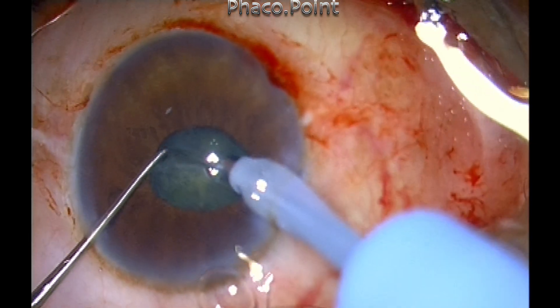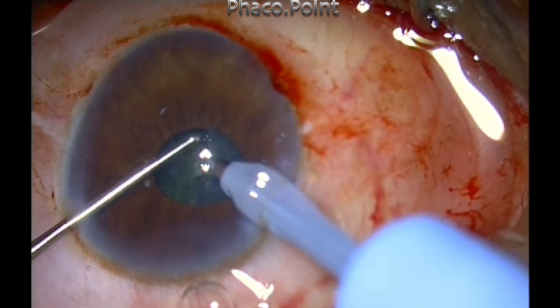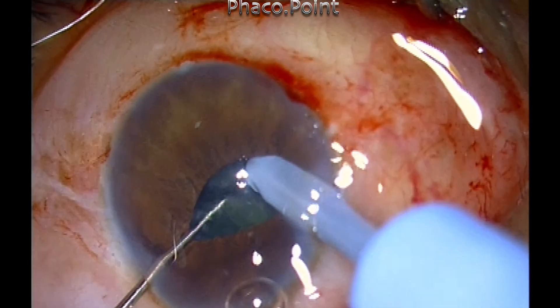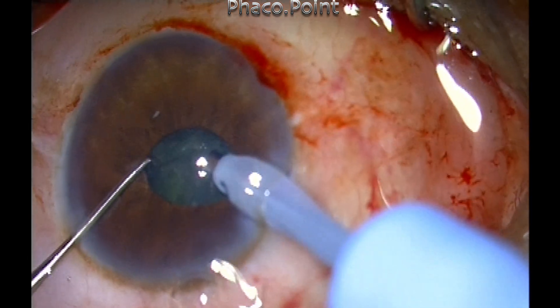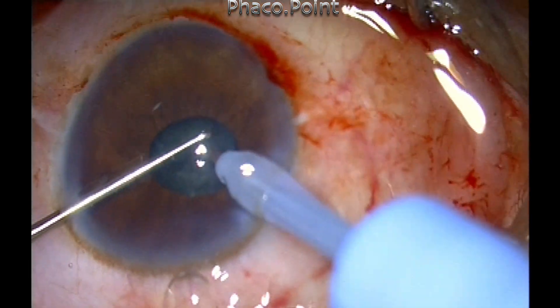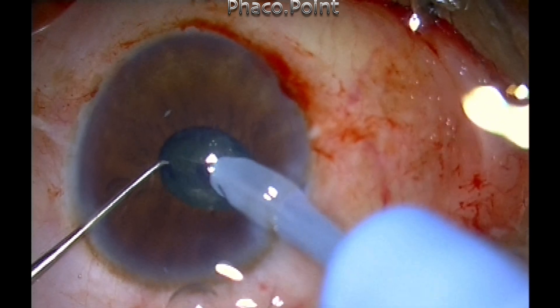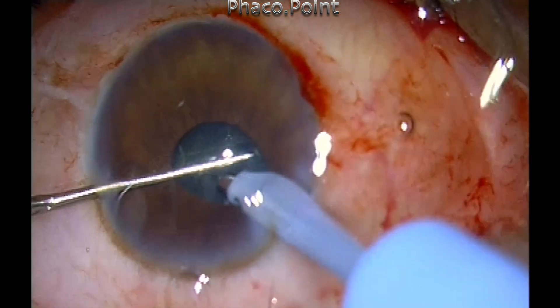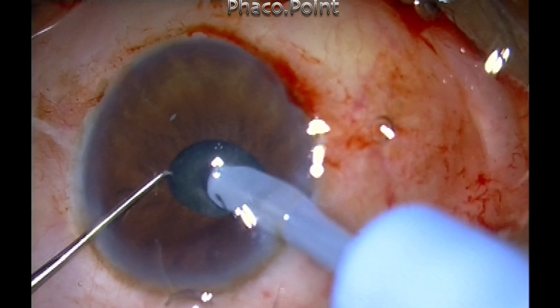You will notice that throughout the surgery I am applying phacoemulsification only within the central inner circle of two millimeters. I am using sufficient vacuum — in this case 350 mmHg — and power of only about 25 percent, because it's a soft grade two nucleus.